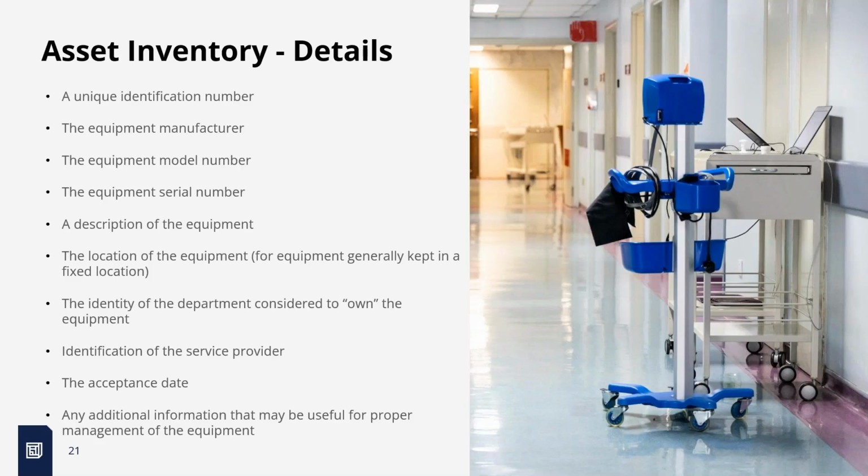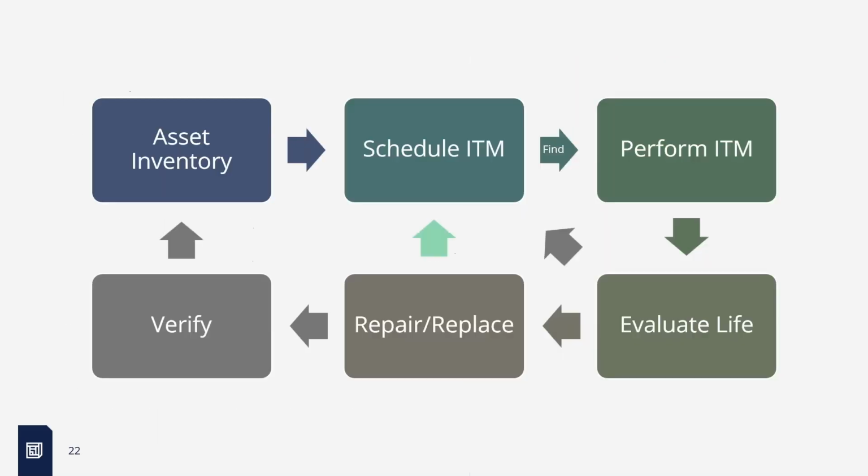As part of this, part of the asset life cycle is performing your asset inventory. So step one is, do you have an inventory, a list of all your assets? And that should live in your CMMS, your computerized maintenance management software. That's going to be your source of truth for what was done to that equipment, what's the useful life of that equipment, when do you need to replace that equipment, and what are all your compliance reporting. That's what your CMMS is for.